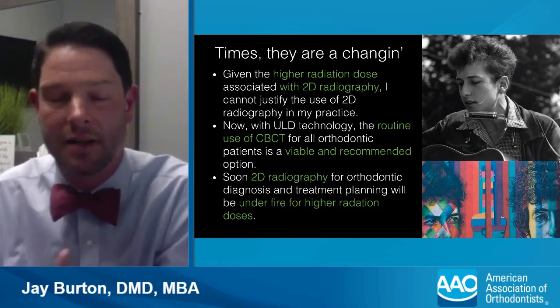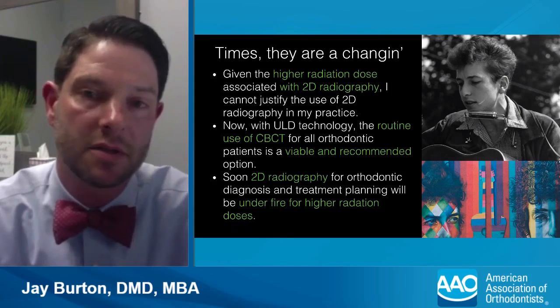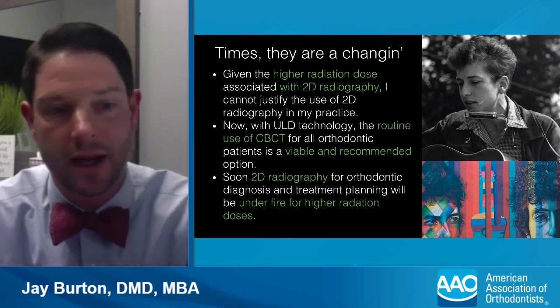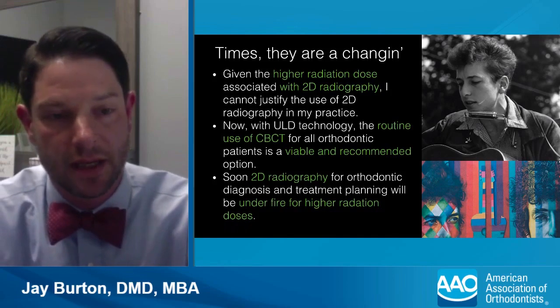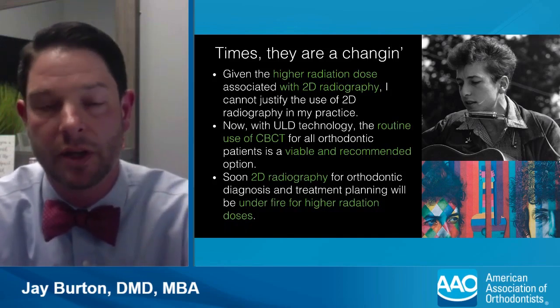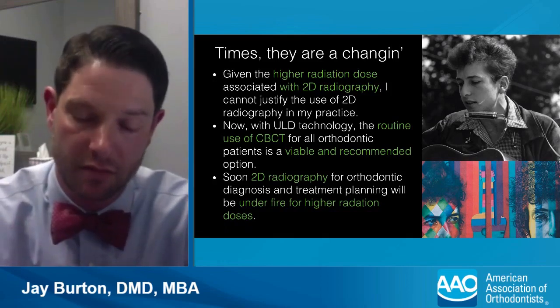I'm just not ready yet, whatever the reason is. But it's not a matter of if you will adopt it. It's just a matter of when. And now with ultra low dose technology, I would argue that the routine use of CBCT is viable and recommended for patients. And soon 2D radiography will be under fire for over-radiating and not 3D like it was several years back.